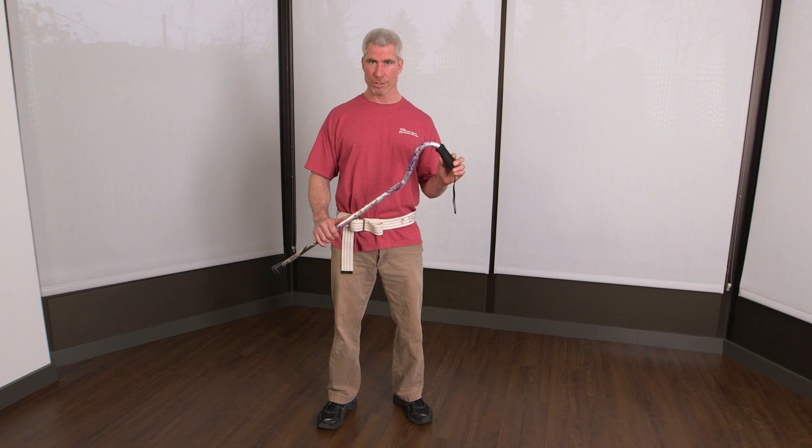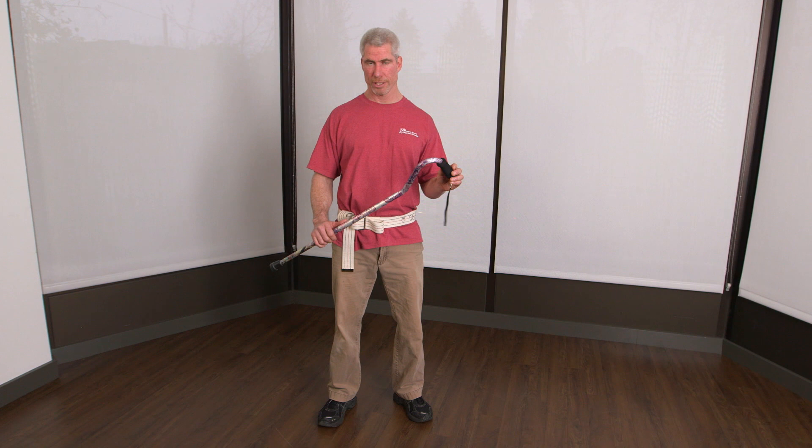Welcome to the Caregiver 101 video series. In this video, I want to show you the two uses for a cane: for support and for balance. The two are a little bit different. There are a lot of videos out there about support, so let's go through that first.